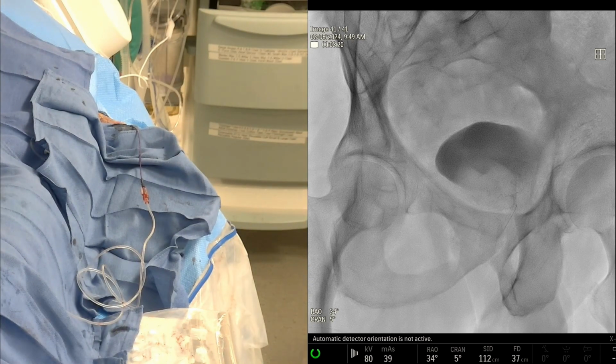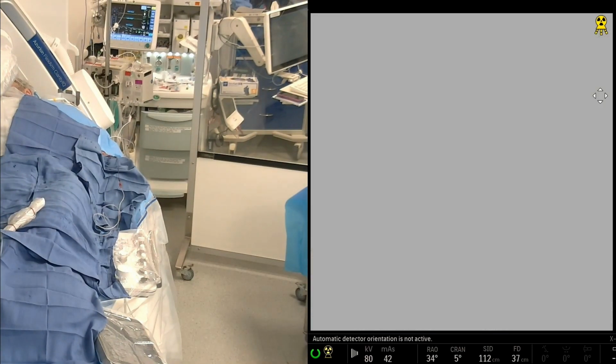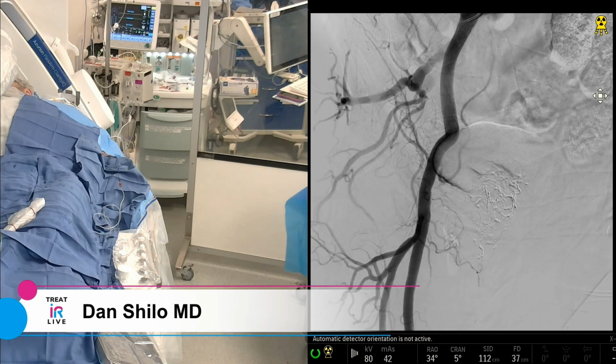All right, so we're going to do another angio here. Aaron, can you talk about the retreatment, the ones you have done? What have you seen? Is it more collaterals? Is it more from the main? Is it different when you've seen particles versus glue?